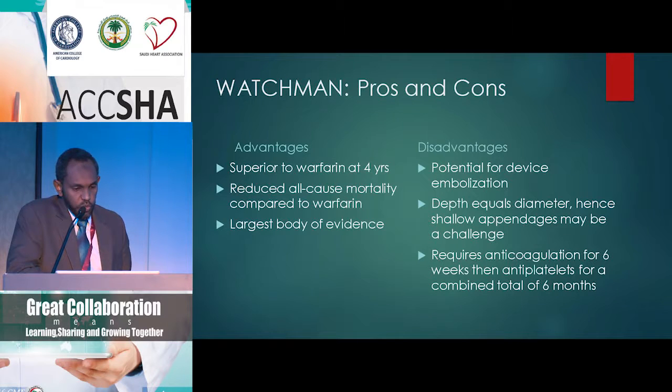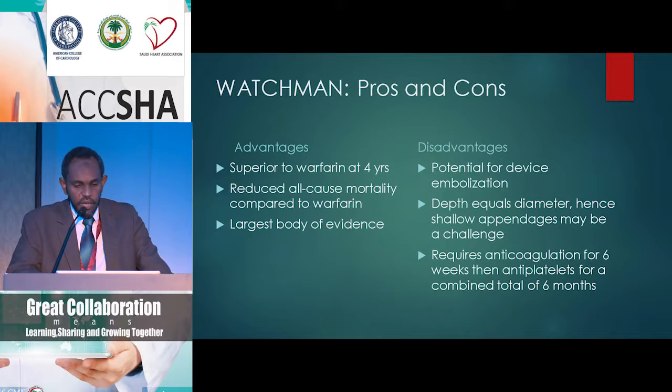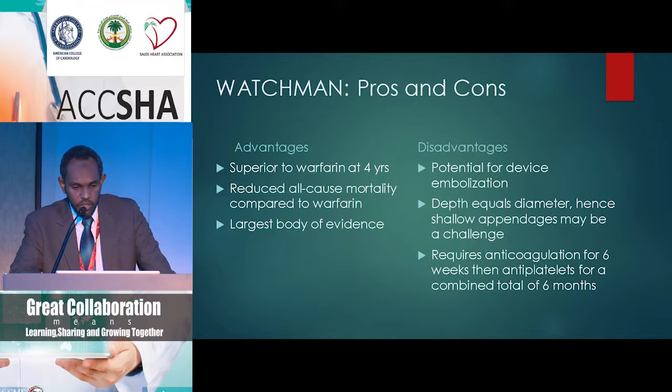It's definitely superior to warfarin by clinical trials. It has the largest body of evidence, and it causes reduction in all-cause mortality, which is really a very hard endpoint. Disadvantages: the device does have a potential for embolization if it's been undersized. The depth of the device equals the diameter, so if you have a shallow appendage, you really can't use the device in these patients. So there are some limitations in terms of anatomic morphology of the left atrial appendage.